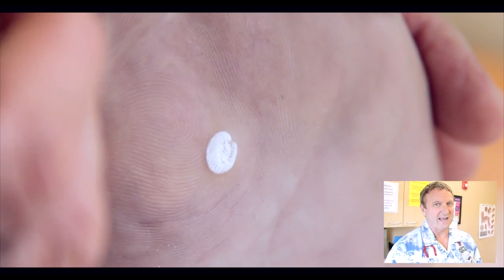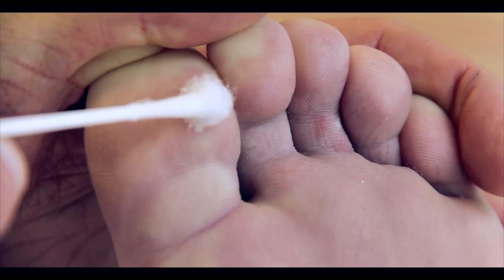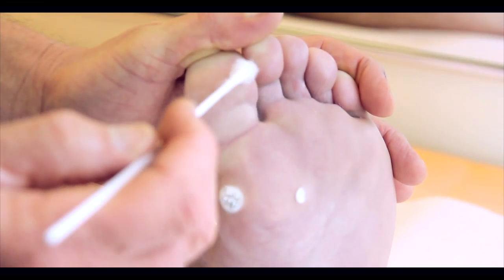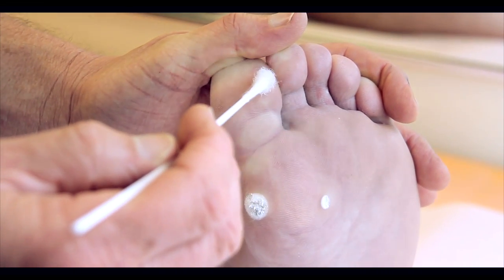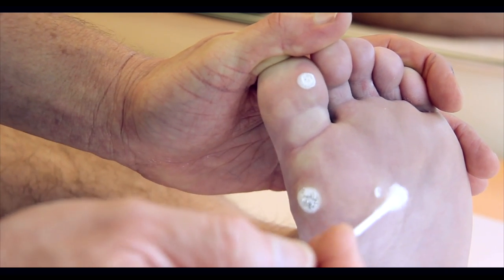They will go away eventually. And actually, it's almost guaranteed if you get a blood blister, that wart's going to be gone. Last freeze and we're done. You're doing great, buddy. I know these hurt. I've been in your shoes. Isn't that toe the worst one? Yeah.